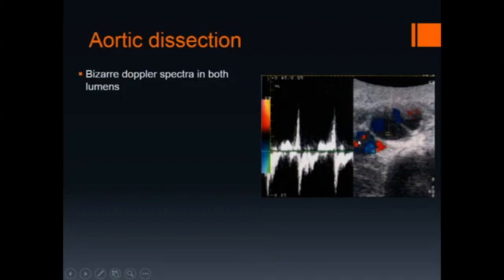If Doppler spectra are obtained from the false and true lumens, a bizarre spectrum may be seen. In this case, there is a dissection flap seen within the abdominal aorta on this transverse image. A spectrum is obtained that is bizarre and does not resemble any physiologic aortic waveform.